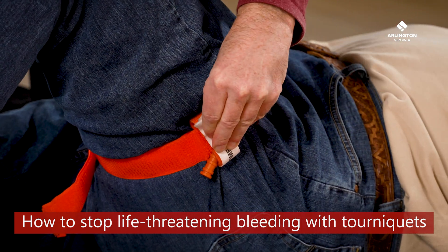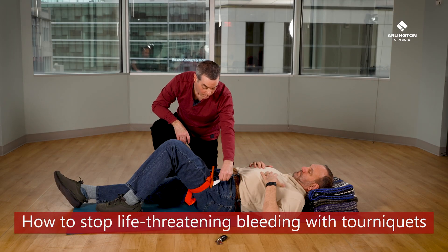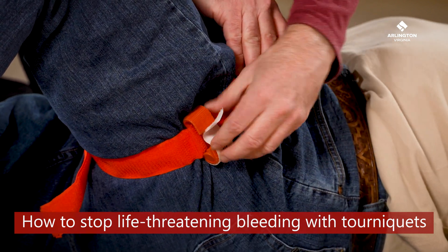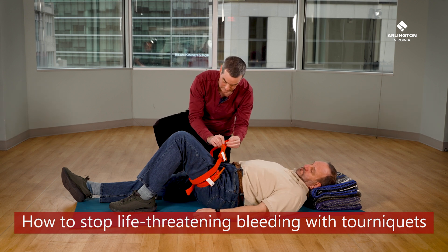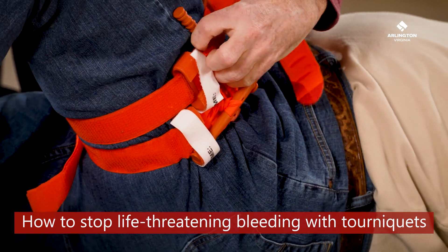If you apply a tourniquet and the bleeding doesn't stop, first check whether you can twist it anymore. If not, you can add a second tourniquet just below the first one. This may be more necessary on a leg than an arm.